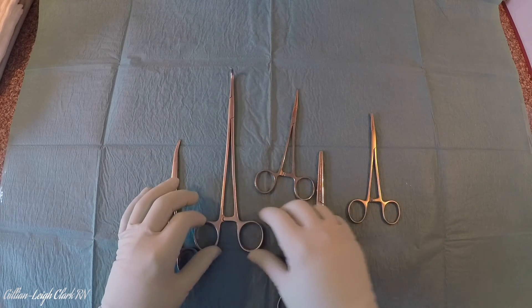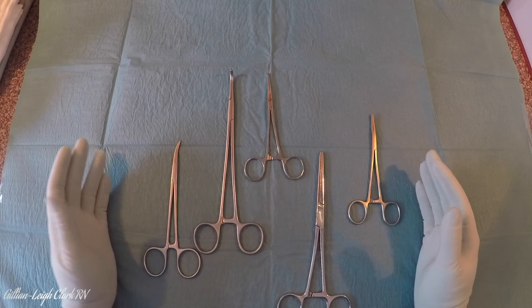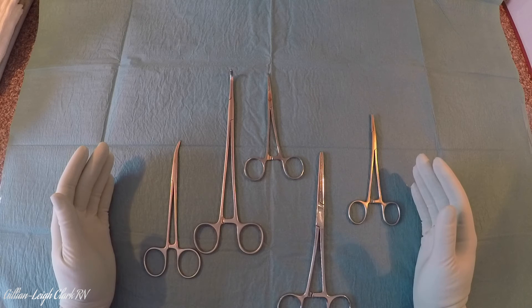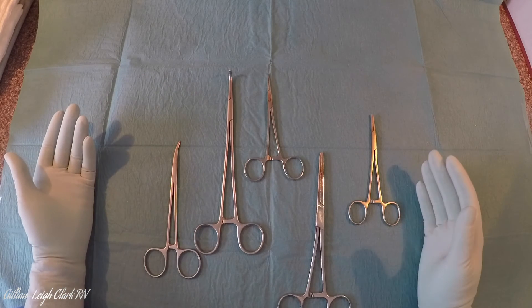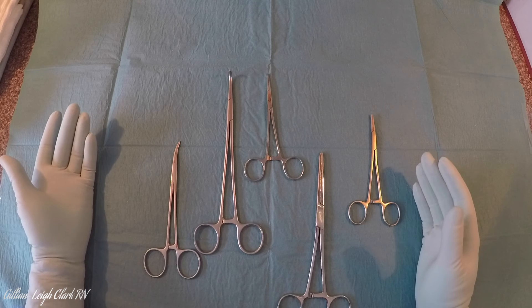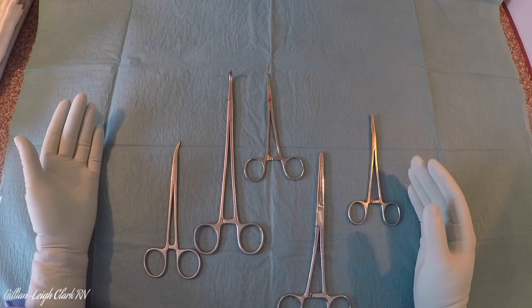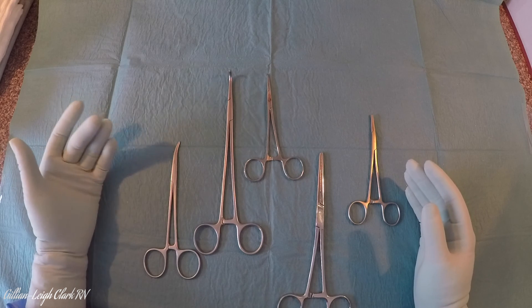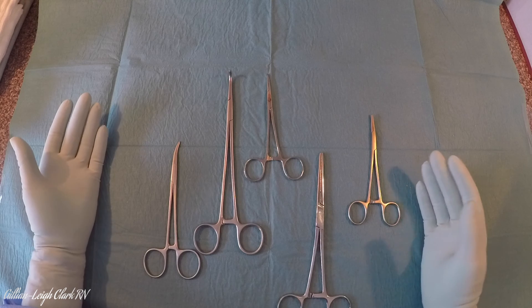Some people will call it a hemostat — it's more of an American term. But if you can identify artery forceps, even just starting with the smallest one on your most common tray — for example, a Cryol or a mosquito — usually they'll be in fives, tens, or fifteens. So you can immediately identify 15 of the instruments on the tray just by knowing those three features. You can then start to work out what the rest of the instruments are. More often than not, you'll have two sizes of artery forcep on your tray: one for shallower work and one for deeper work, whether that be mosquitoes, Cryols, Grey Turners, or Roberts. That gives you a fighting chance of knowing the rest of the instruments. I hope that helps.